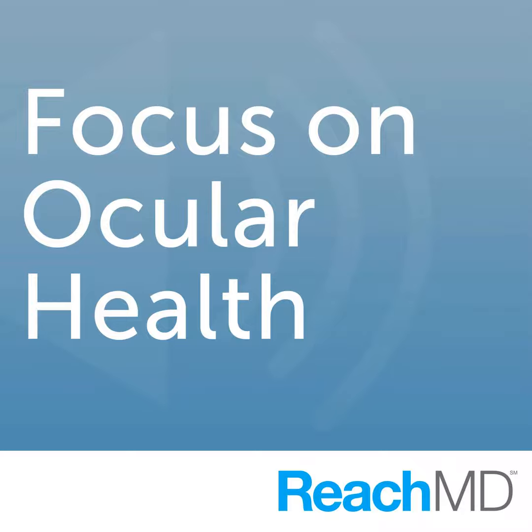And when you implant this chip, where is it placed? This particular chip is called the Argus series, and the company that makes it is Second Sight Medical Products. And the Argus 2 chip, which is the one that's in international trials as well as nationally, so it's in about 4 centers in the United States and 4 internationally. This particular chip is placed in and around the eye.